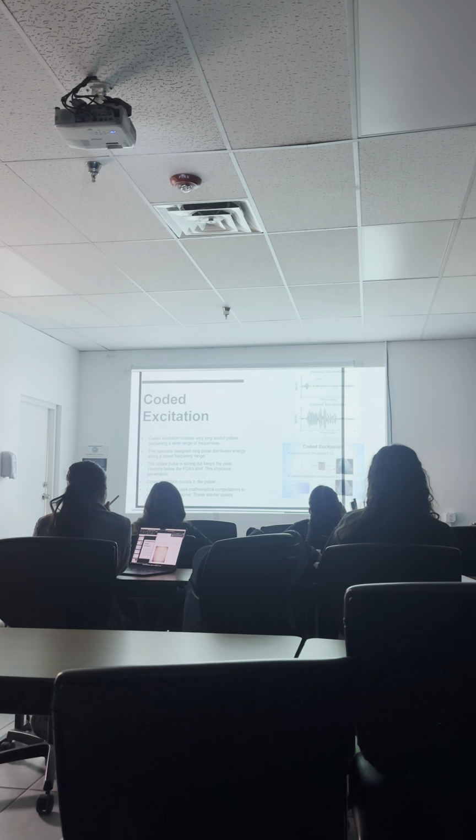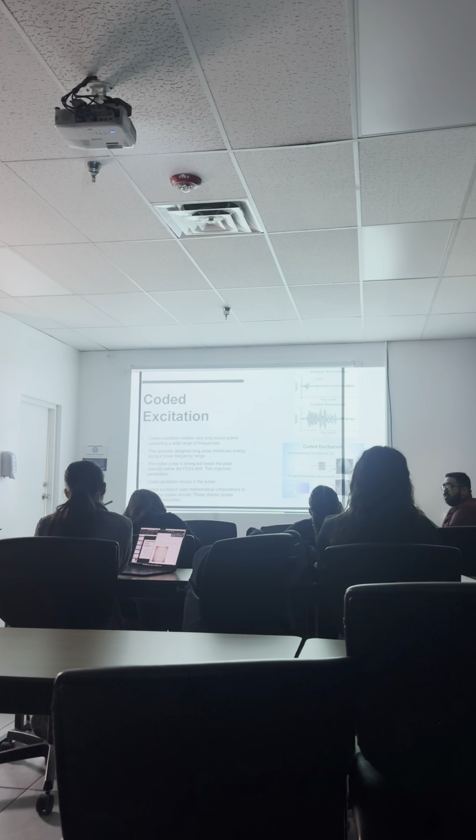This improves penetration, okay? So we do deliver higher voltages for a longer time, but it's below the standard that the FDA has set, so that the bioeffects are still kept to a minimum. So how does coded excitation help?